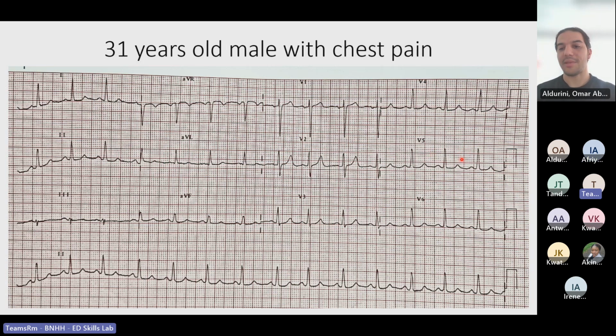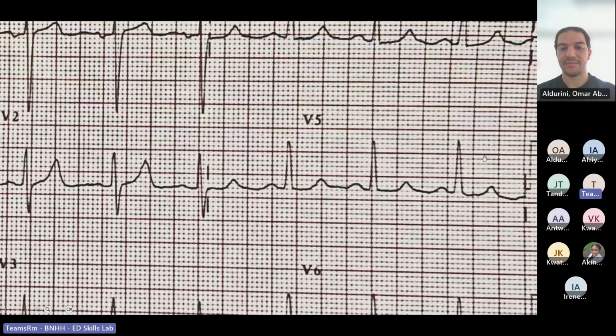So let's say these are 3 and 2 small squares here. Enlarge it for it. I will pick these two just for the sake of simplicity. So this is 1 big, 2 big squares, 3 big squares, and 2 small squares. And each big square has 5 small squares in it.